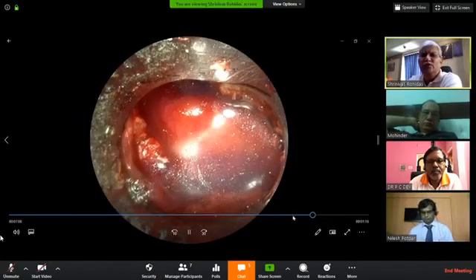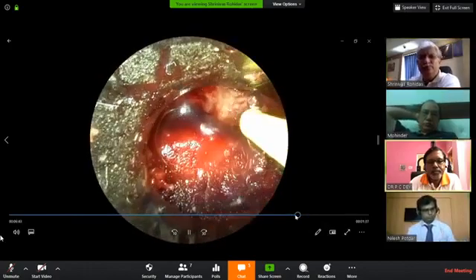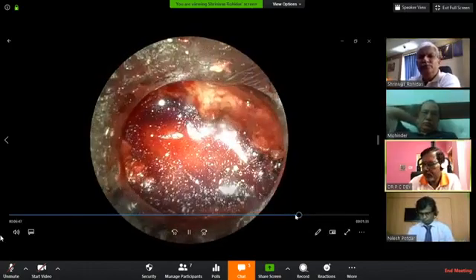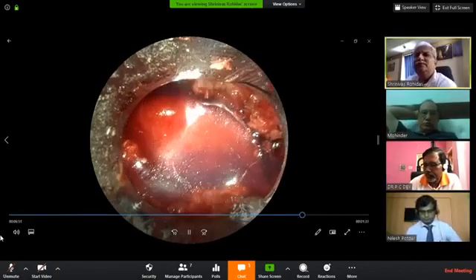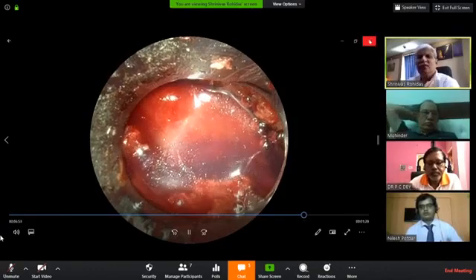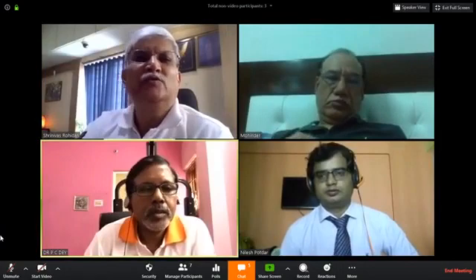And then over this, we have put fibrin glue. This is complete sealing of the dural tear. Okay? Yeah, nice. Good.